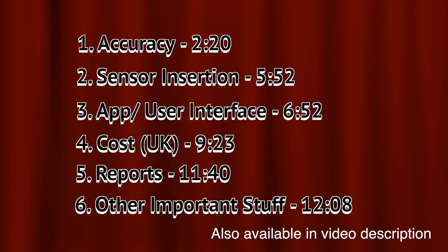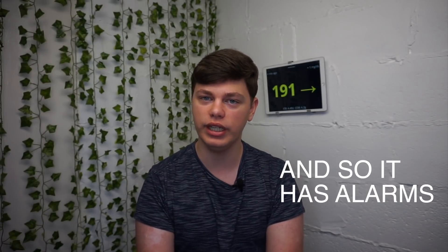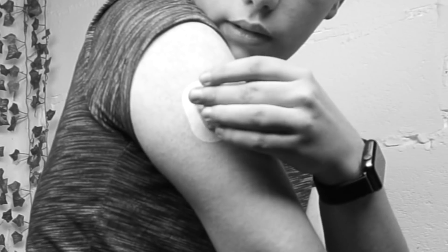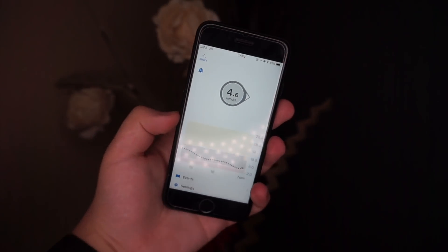If you already know how they work, feel free to skip ahead to category one: accuracy. The Dexcom G6 is a real continuous glucose monitor that sends blood glucose data every five minutes. It has three components: a glucose sensor lasting 10 days, a transmitter lasting three months, and a receiver device — either a Dexcom receiver or your smartphone. The Freestyle Libre is a flash glucose monitor that measures glucose the same way but stores data locally.